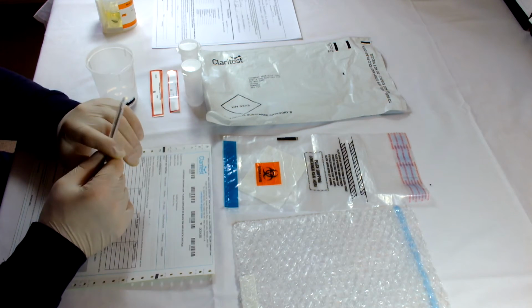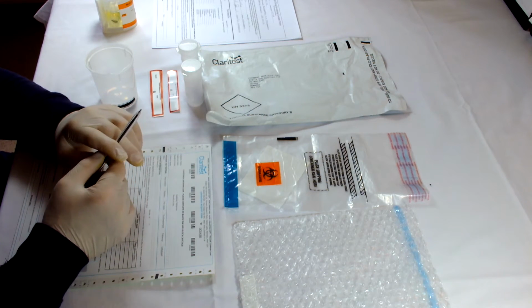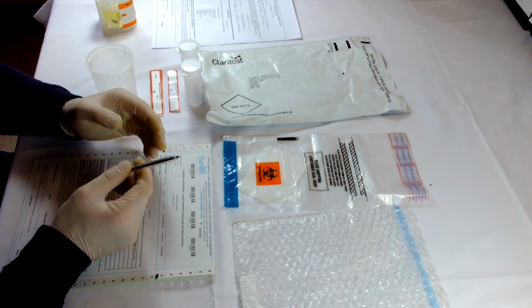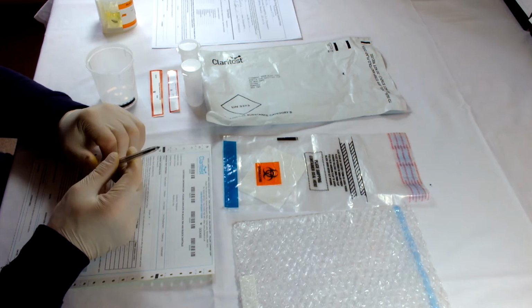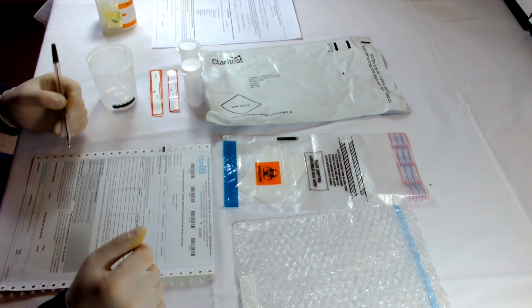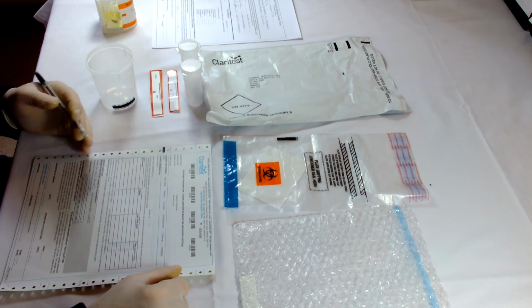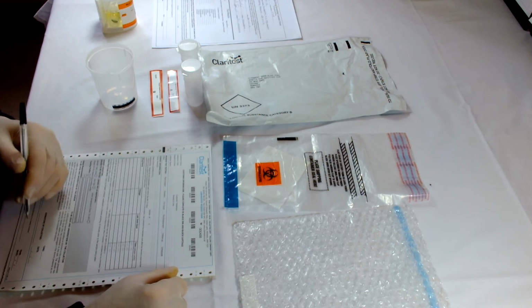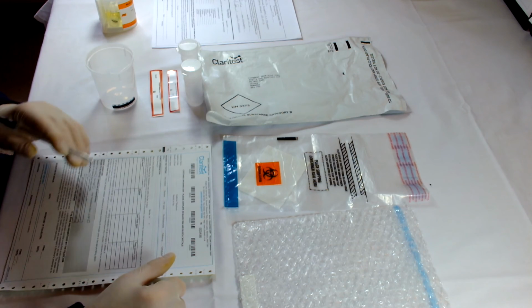However, when you buy the initial kit, it only includes the test for one drug. So there will be an additional charge for any extra drugs that you want tested for. There's then a donor consent form. We read this out to the donor and then ask them to sign it and date it. And then the collector signs and dates the form as well.